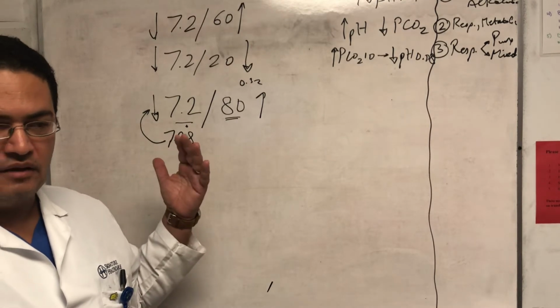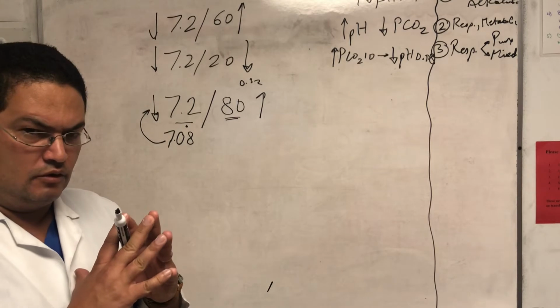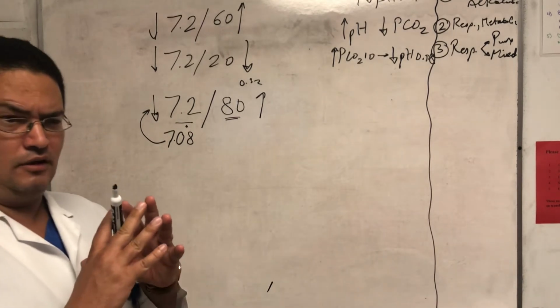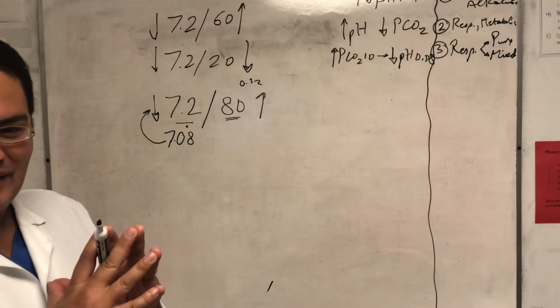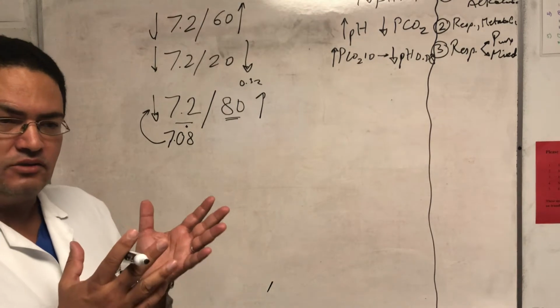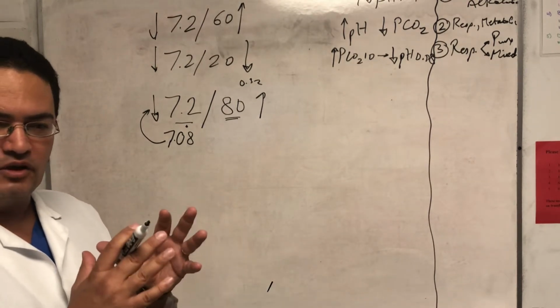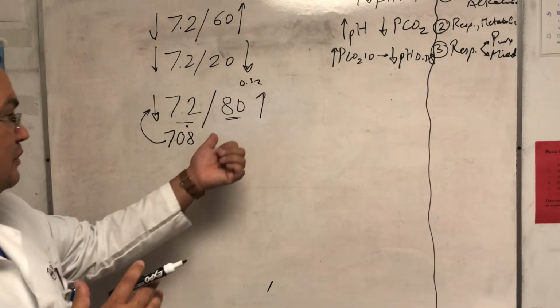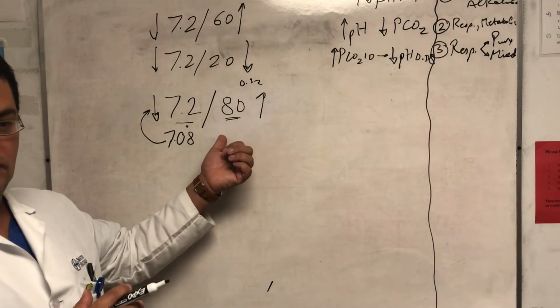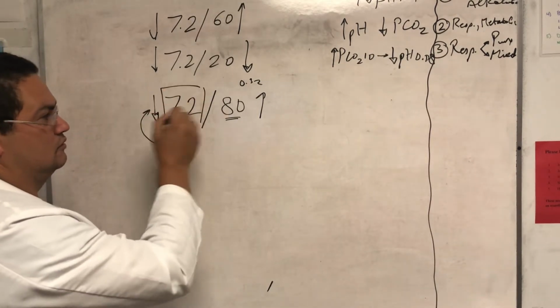And that's why I sometimes laugh at people who say, well, we don't know what PCO2 he lives at. Let's call the other hospital. We're waiting for the record to know what his usual PCO2 is. It's a fallacy. That's wrong. I can tell you, not exactly, but very much in the ballpark, where this patient's PCO2 is. How? I just want to make this 7.4.